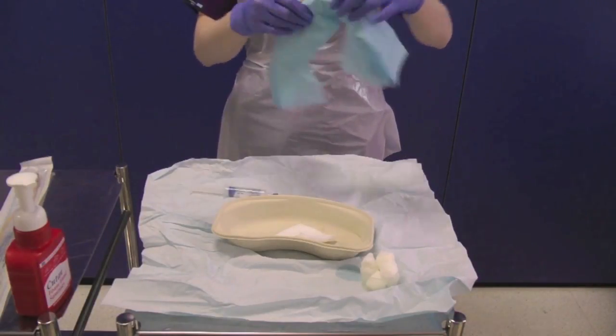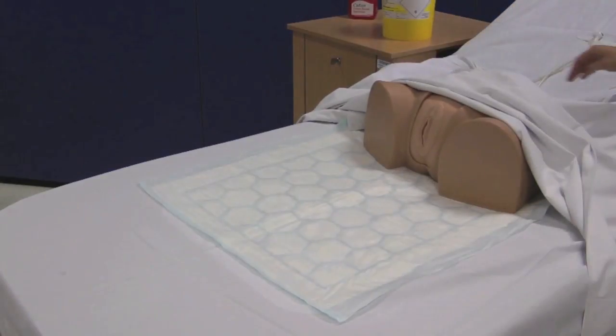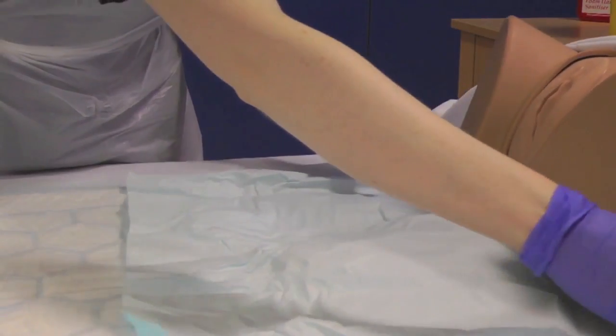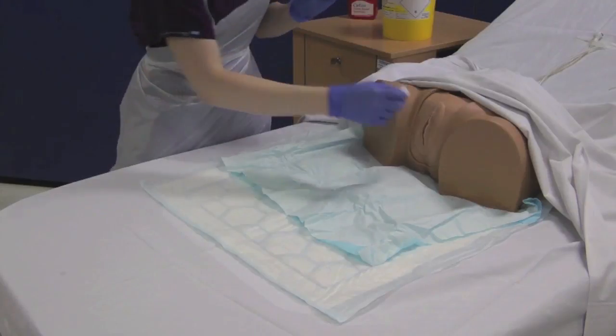Open out the sterile drape. Ask your assistant to expose the patient. Note the presence of the Incopad to prevent soiling of the bedsheets. If the patient is able to, ask them to assume the lithotomy position. Take the sterile field from the catheter pack and place under the patient.